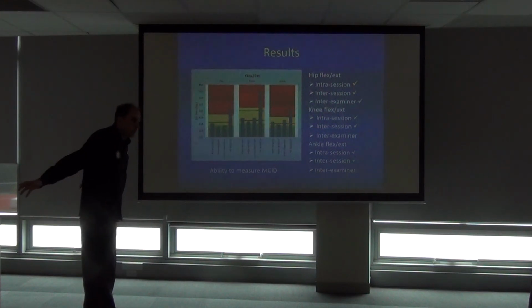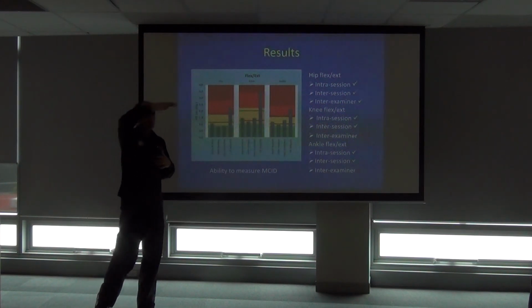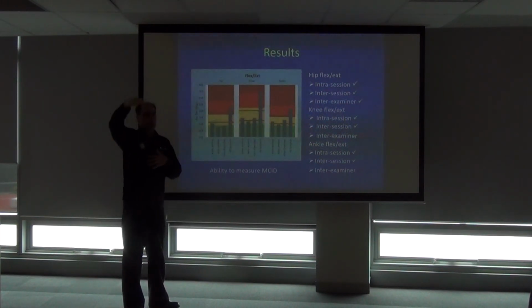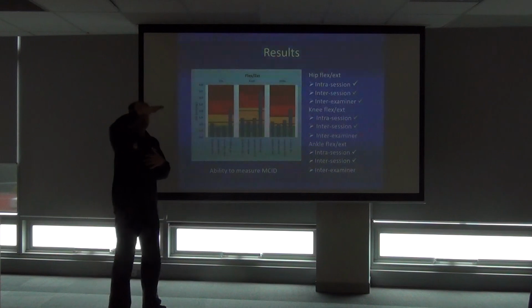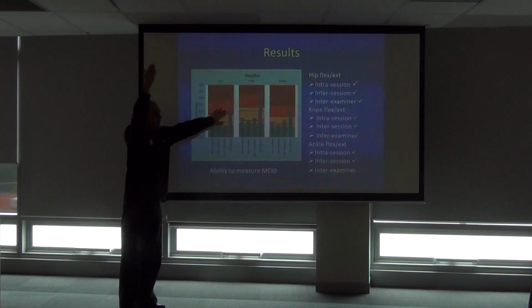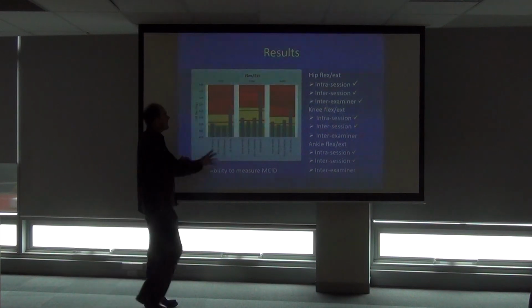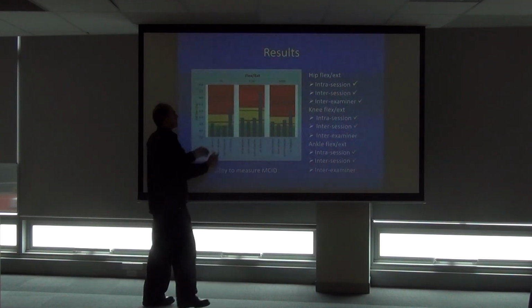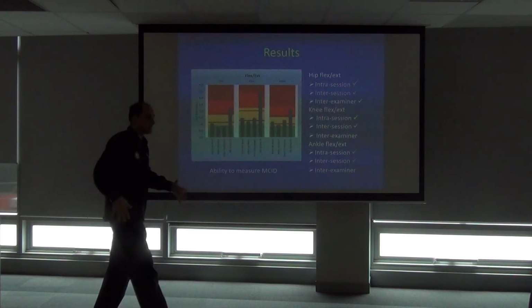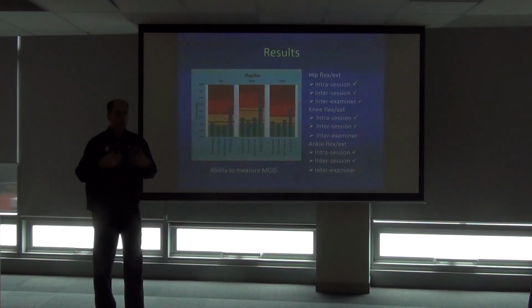If we just plonk all 12 subjects together, so these reliabilities are intra-subject, within a subject under the same conditions, or the same examiner or different examiners, but within a subject. This is just all subjects, the total variability across all subjects. So you can see, as a group of subjects, they were quite different, well, different to unrelated as individuals. So there's quite a bit of variability in their movement patterns. But within a subject, they were quite tight.